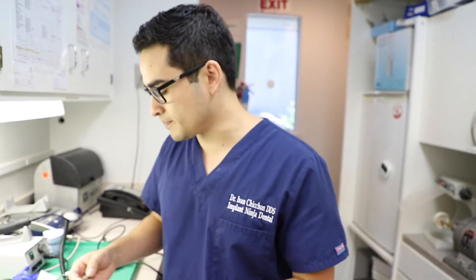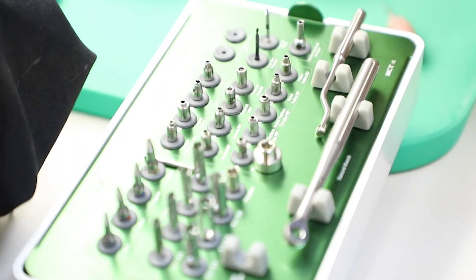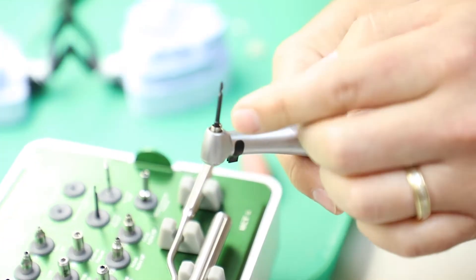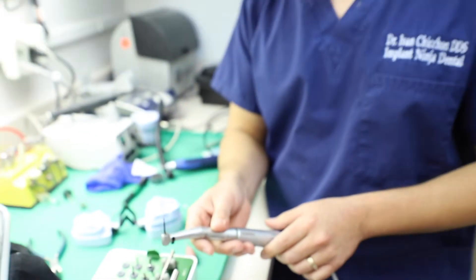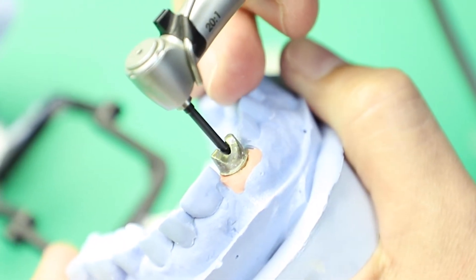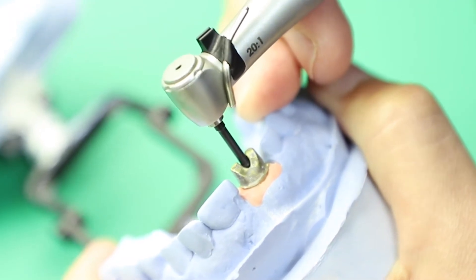But if that's not working and it's not coming out, then you can use a screw removal tool. This is my screw removal kit. The first bit I'm going to use is this one right here. I'm going to run this on reverse at a thousand RPM, putting this into the abutment at a thousand RPM in reverse.